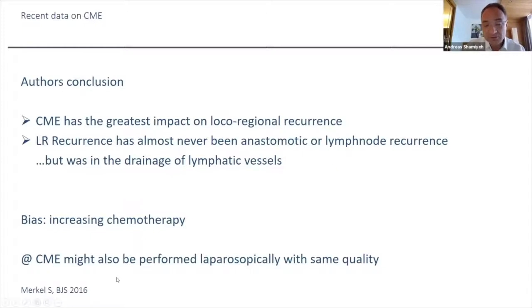The CME is of course not only possible open, but is really nice to perform laparoscopically with the same quality. Which route should we take? We have to take the right branch of the middle colic artery, but not the left one, as well as the lymph nodes on the gastro-epiploic side.